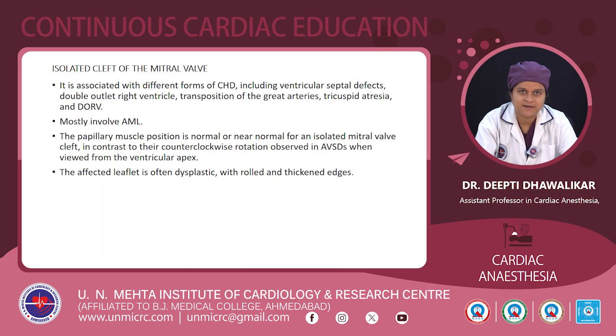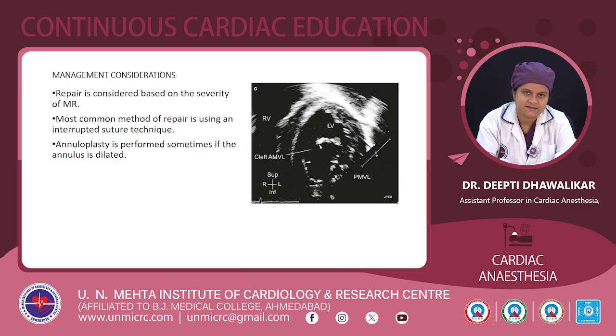Isolated clefts of the mitral valve. It is associated with different forms of congenital heart disease, including VSDs, DORV, TGA, tricuspid atresia, etc. Mostly they involve the AML. The papillary muscle position is normal or near normal for an isolated mitral valve cleft, in contrast to counterclockwise rotation observed in AVSDs when viewed from ventricular apex. The affected leaflet is often dysplastic with rolled and thickened edges.